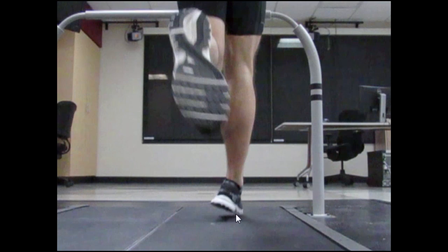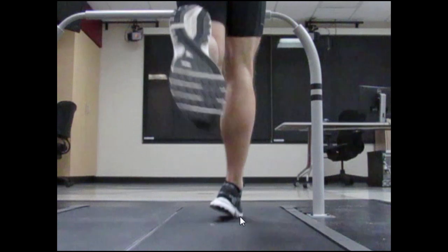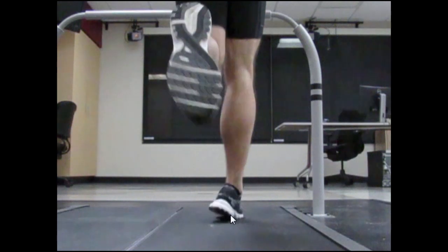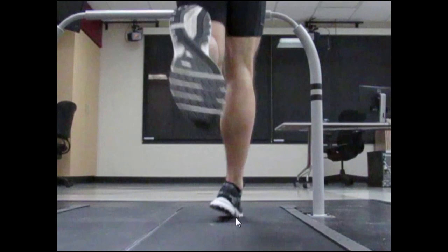This is typical for a forefoot strike pattern, and that contact does not occur under the first and second metatarsal areas, but first contact happens more at the fourth and fifth area. The pressure is rapidly moved over to the medial aspect. So if we back up 2 frames, initial contact is here, with pressure largely in that area.